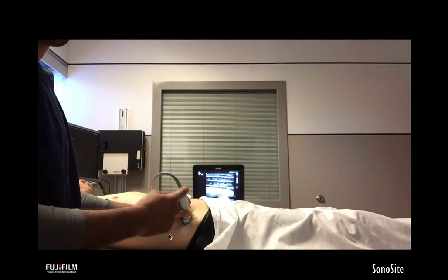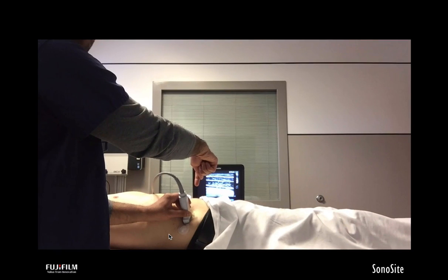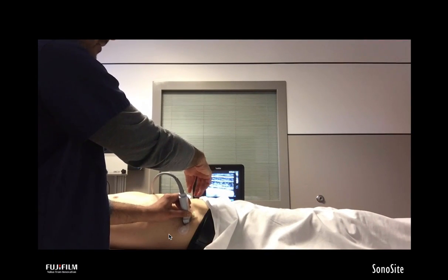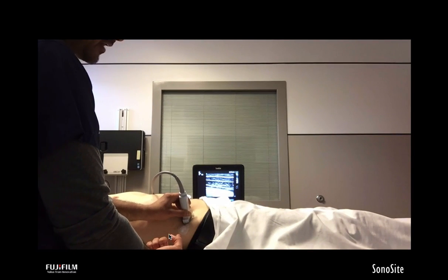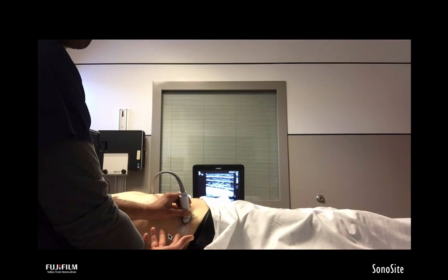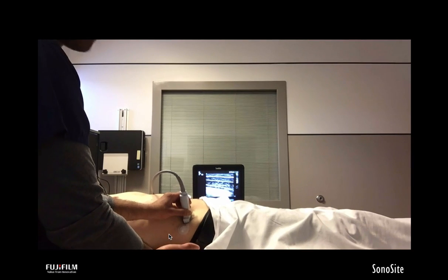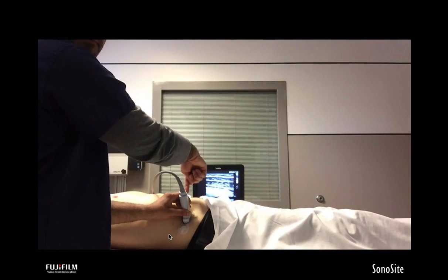What I want to do is come with the needle from the medial aspect. The reason I want to come with a needle from the medial aspect is that ergonomically this gives me a better angle with which to do the block. If I try to do the block from the lateral aspect, on him he's very thin, so it would be easy, but on other patients who have a lot more abdominal girth, that wouldn't be easy, and you'd be compromising sterility as well by touching the bed. So we would come in from here.